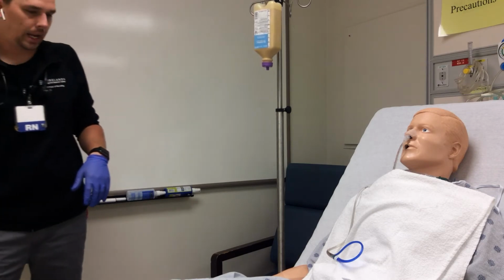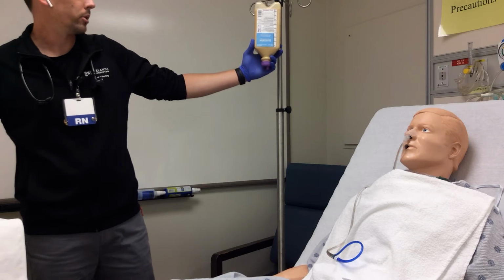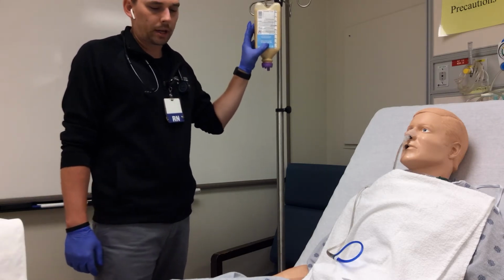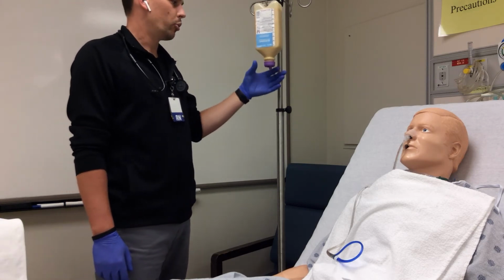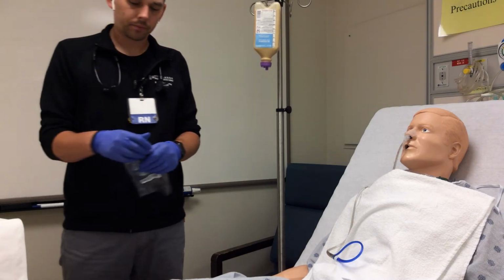So we have labeled it, and these bottles, once spiked, are good for 24 to 48 hours. Again, it depends on your institutional policy. The bottle itself says if spiked and left connected, it is good for 48 hours. If at any point we disconnect the tubing, then it's only good for 24 hours.